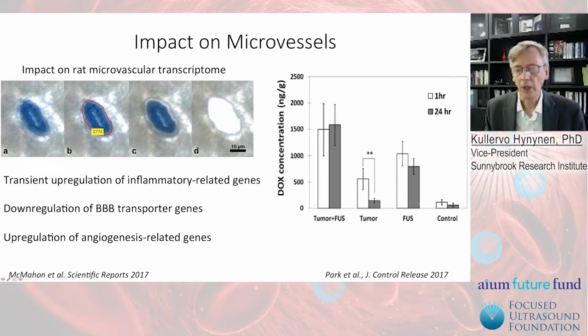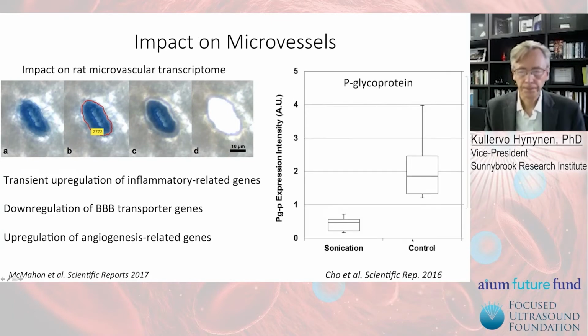In the same way, with focused ultrasound in normal brain tissue, there was much more drug right after the sonication than without sonication. And it also stayed there at 24 hours, indicating the efflux pumps are inhibited. And this is another study showing the same effect.